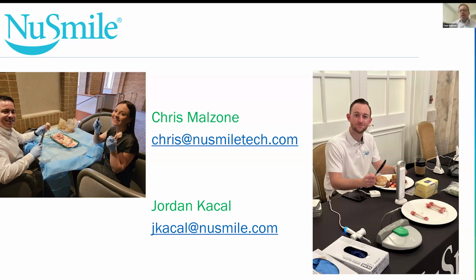One more question came up. Any tricks for patients that have a thicker cortical bone? I feel like I'm not getting good penetration of the needle. So the first thing is, if you're trying to do that 16, surrender. I was getting very frustrated with late mixed and adult dentitions trying to get a 16 through. I had a lot of bends. So that's my first bit of advice.